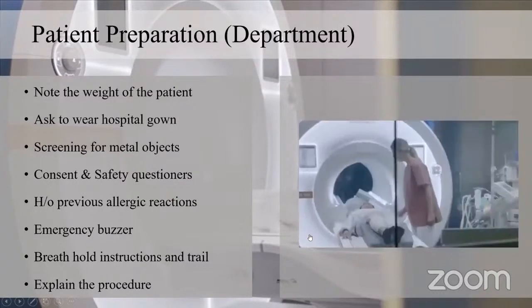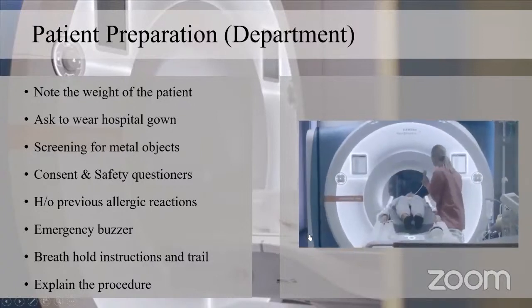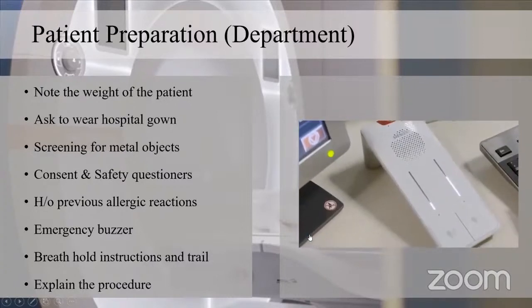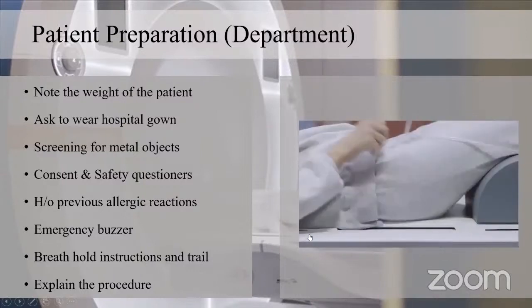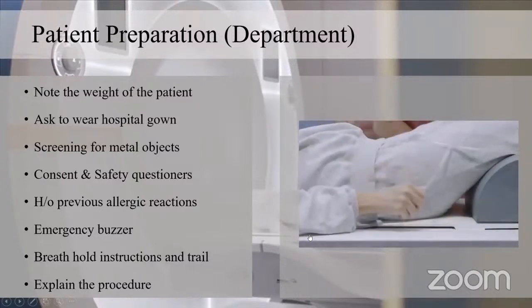Next, in case the patient wants to contact the radiographic technologist during the scan, for example if the patient is not feeling good, we can give an emergency bell to the patient. If the patient needs to contact the technologist, the patient can use the emergency bell.